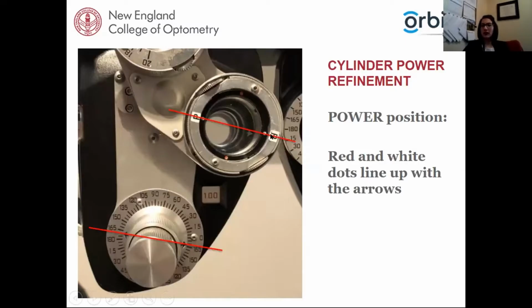And it doesn't matter if you line the white dots or the red dots up initially. As we give those choices, 1 or 2, the red and white dots will swap. So it doesn't matter where you start.